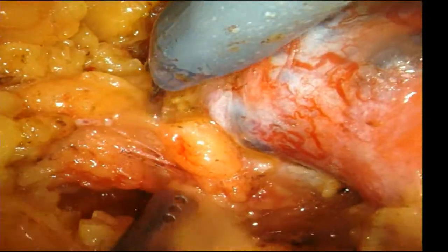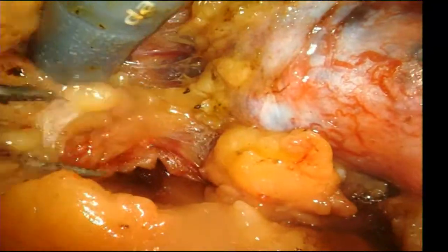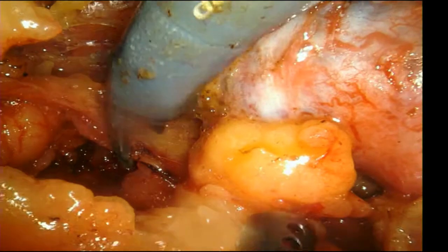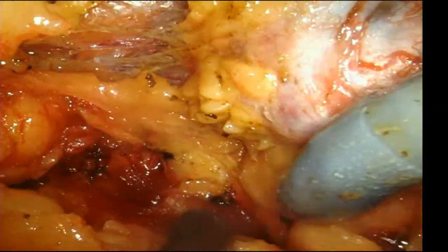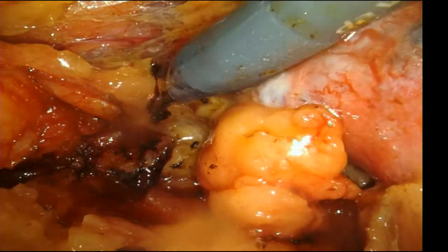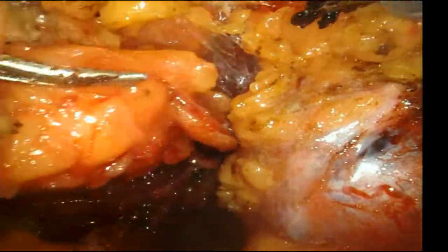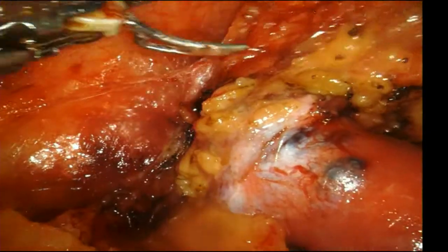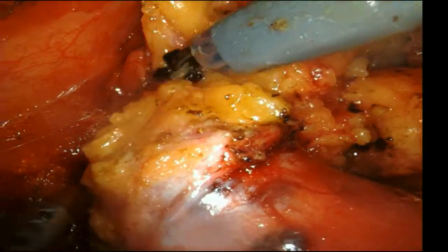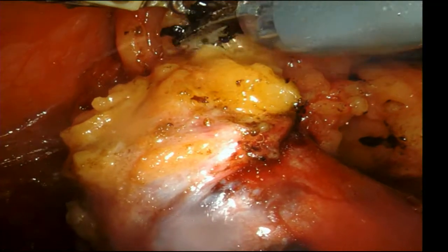One thing that's important, though, on that same line of thinking, is that when we go on clamp, we have a sterile communication environment. So there's no music playing, there's no extraneous talk. We ask anesthesia not to do any shift changes while we're on clamp. It's like 15 minutes, but it's important. We really try to minimize the foot traffic in and out of the room, and we put a sign outside the door. So we really try to control the environment when we're on clamp. Yeah, we have a safety checklist that everybody follows, and one of the first things is we turn the music off.